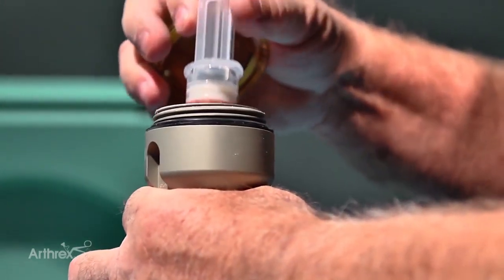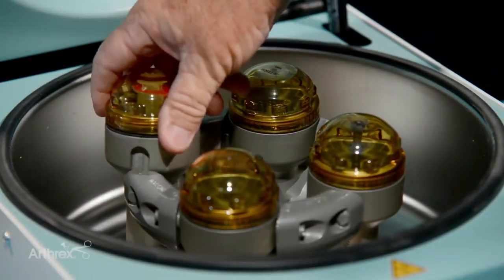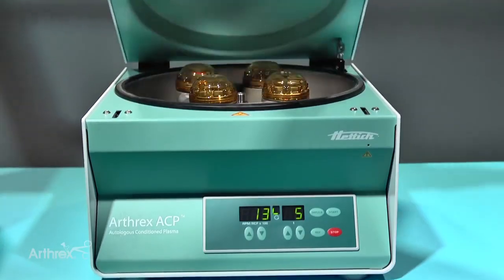Okay, we'll take one of the swing-outs, put your product in, and 1,300 RPMs for 5 minutes.